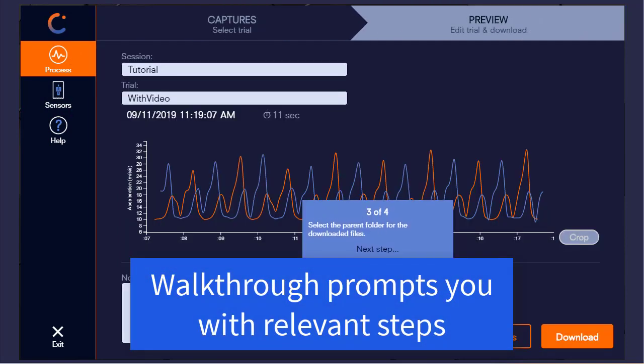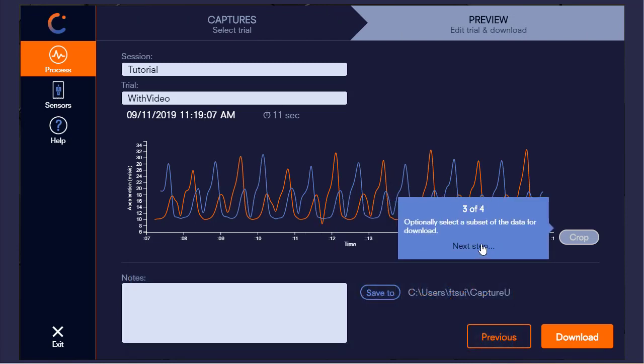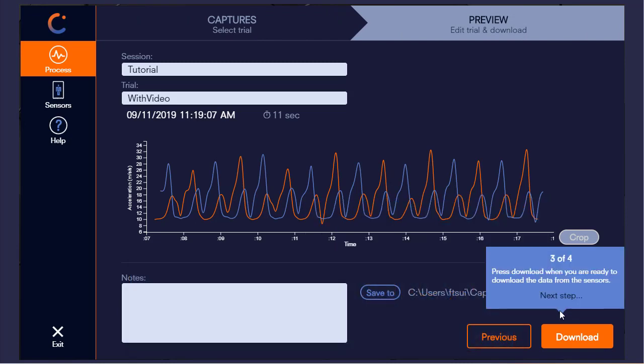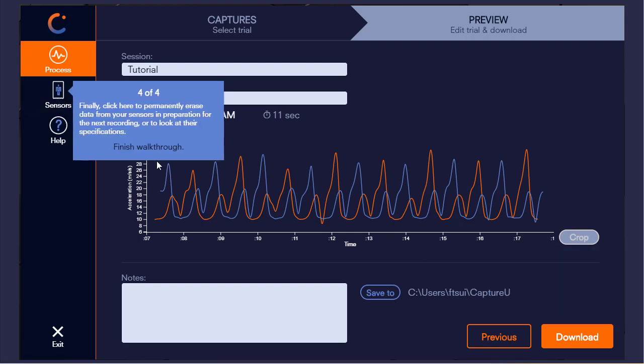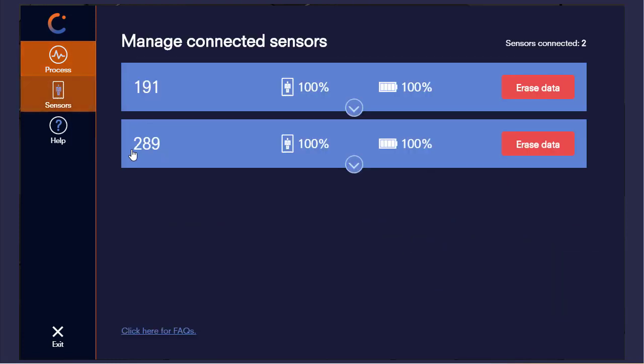Change the download path if I like, crop if I choose to, and then go ahead and download the data. Finally, I can go back to my sensors and manage them, perhaps erasing some of the data. So this is a nice way of reviewing and refreshing the workflow within the software.